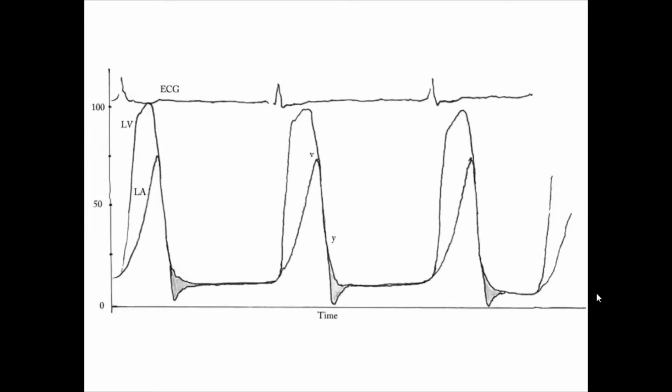So who can take this one? This is a simultaneous hemodynamic tracing between LV and the left atrium, with ECG tracing. ECG tracing, don't forget, and scale. With ECG tracing showing sinus rhythm. I told you, are you sure it is sinus? Defend yourself. Why is it sinus?